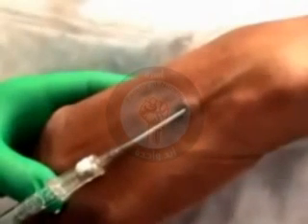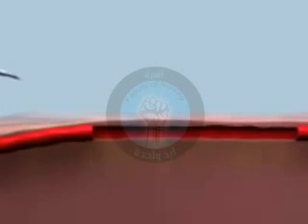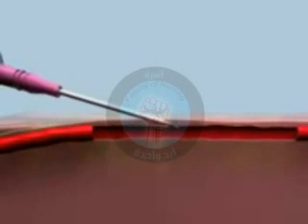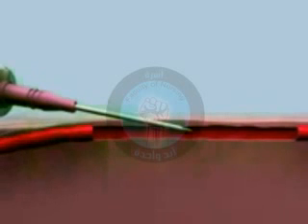When the catheter enters the vein lumen, watch for the initial flashback of blood, which will slowly fill the catheter chamber. Once the metal needle and plastic cannula are in the lumen, lower the catheter so that it is almost parallel to the skin.